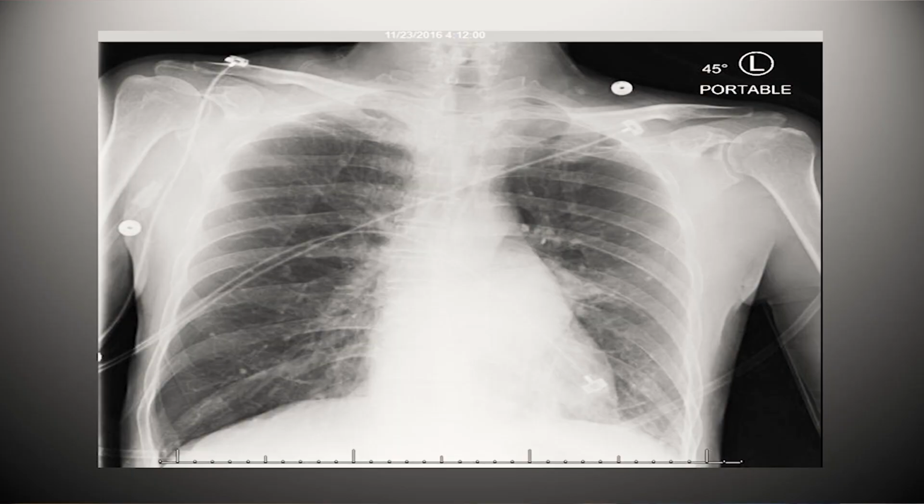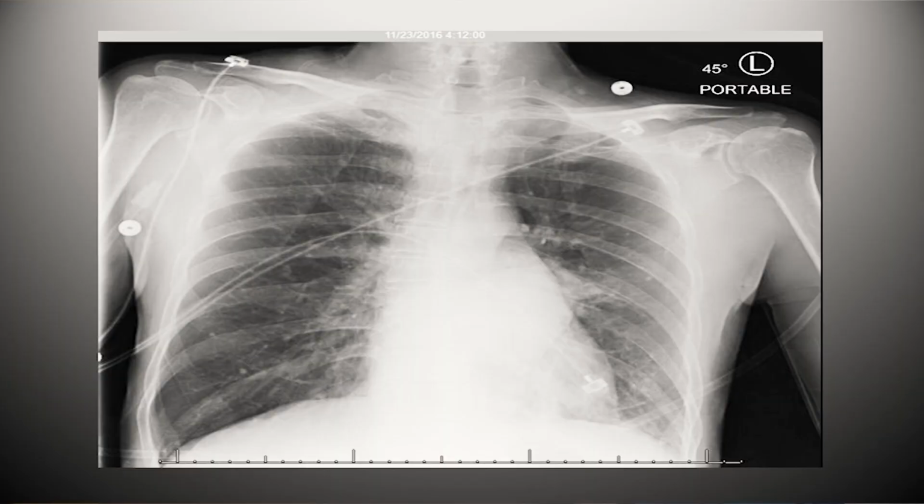So this is a very typical chest x-ray of a hemoptysis patient, meaning you won't see anything, okay? The x-ray is not going to help you in any way. So again, don't waste time getting a chest x-ray, etc. If it's available, very good. But you don't want to say, first get the chest x-ray and then we will proceed, if they're bleeding that much. So for the basic workup, a chest radiograph is probably going to be there because these are sometimes acute on chronic cases.